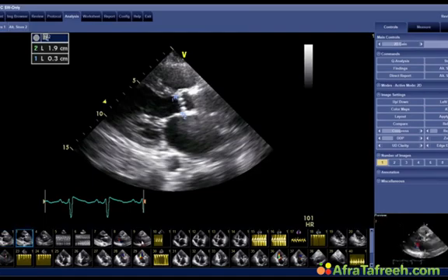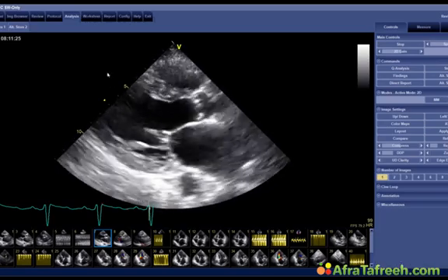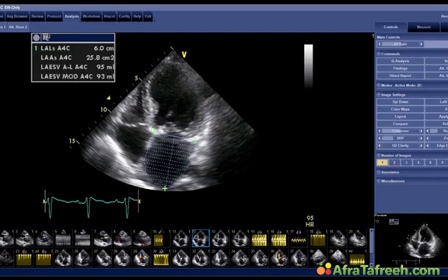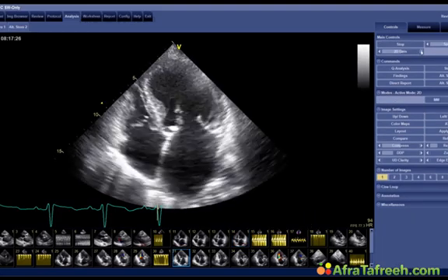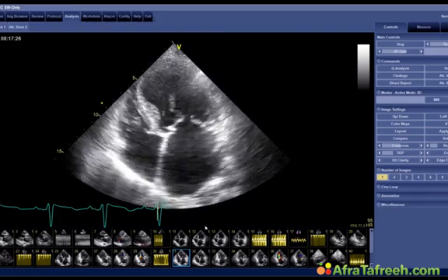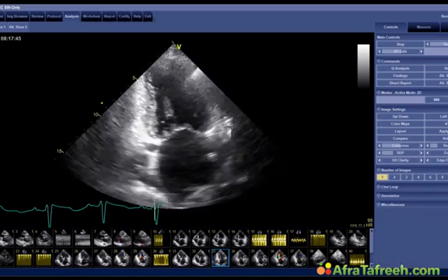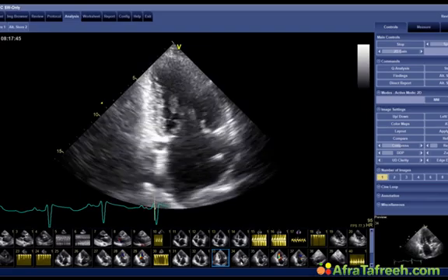Just looking at the morphology, you will probably not recognize that much has happened. There's still aortic stenosis, but what is pretty apparent is that now she has poor left ventricular function. Left ventricular function is significantly reduced. Let's see if I can find the best image. Here, this is left ventricular function. You can clearly see that the ventricle is now much larger than it was previously. It seems as if the left atrium is larger than before. This is her two-chamber view. Look at the two-chamber view, and now the apical long axis view.